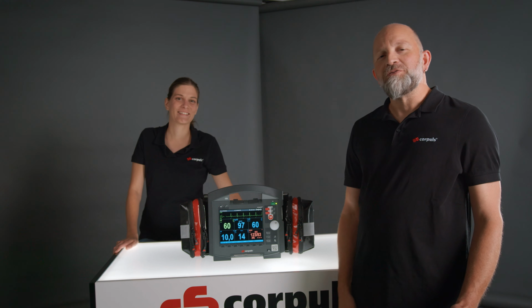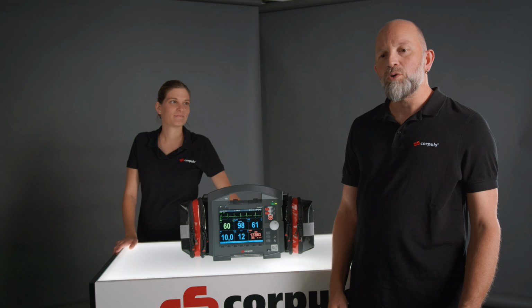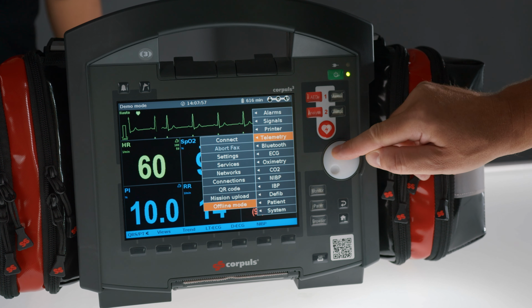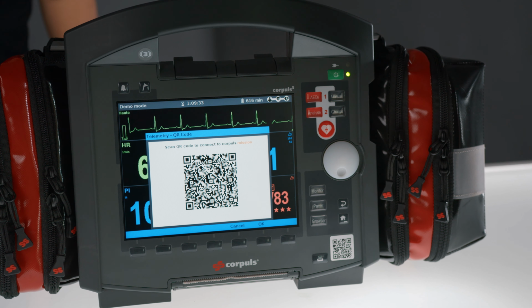A QR code is required for data transfer from corpuls3 to corpuls mission, conference or report. This was previously placed on the device. This is no longer necessary as the device generates a QR code for this connection under the telemetry menu.